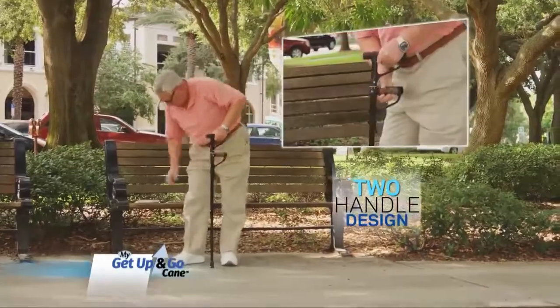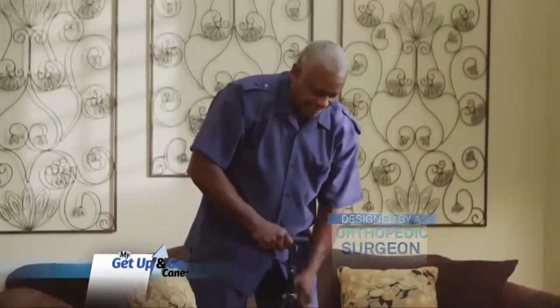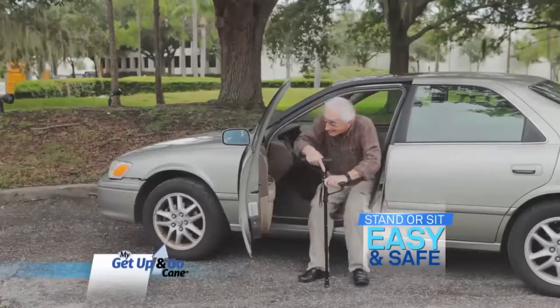The first cane with a second handle, designed by an orthopedic surgeon to help you or someone you love stand up or sit down more easily and safely.